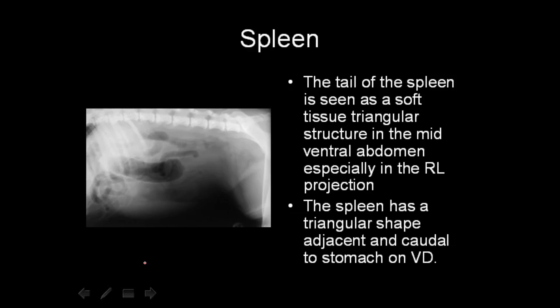The spleen: we see the tail of the spleen, which is usually ventral and very commonly triangular in dogs. On a ventrodorsal view, the head of the spleen may be seen behind the stomach on the left-hand side. In cats, we rarely see the spleen, and if we do see it, it usually suggests splenomegaly, though newer information indicates we can also see it in normal cats without any splenomegaly.